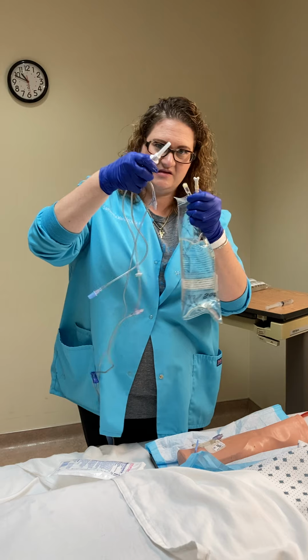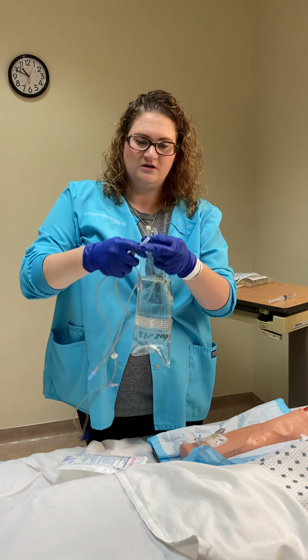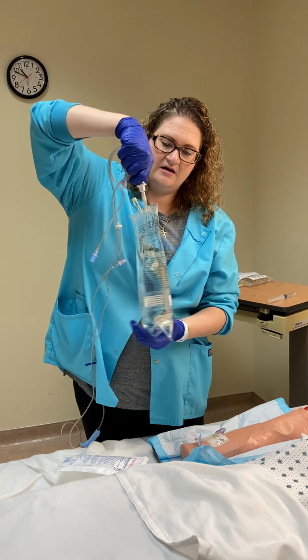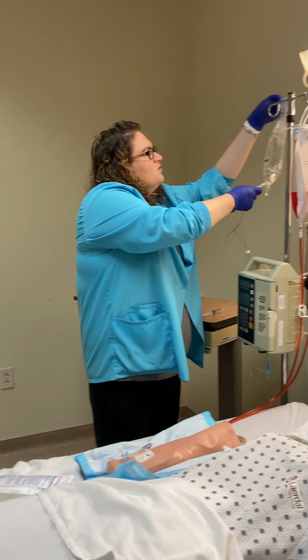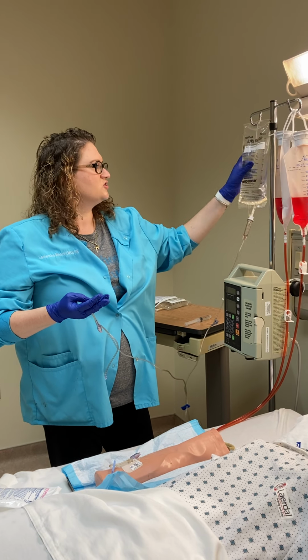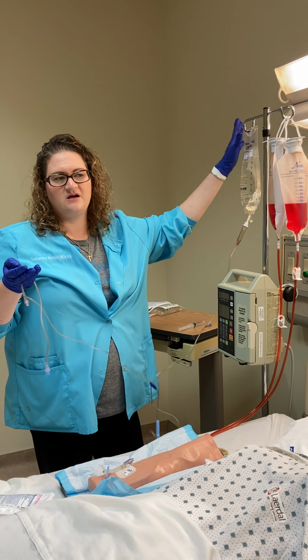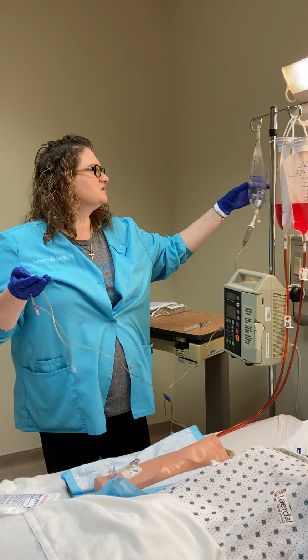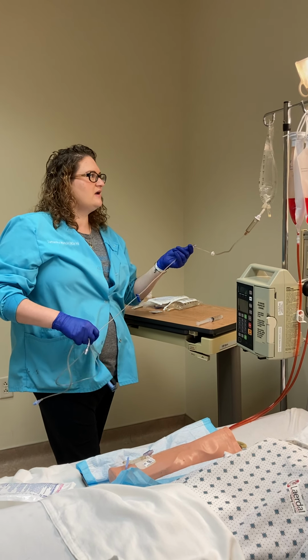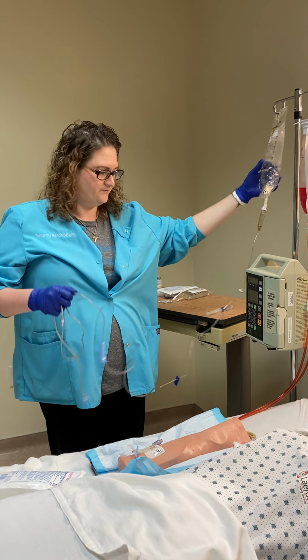But we need to be sterile to sterile, so I'm going to undo my golf tee. I'm going to take my cap off, and I'm going to use some good pressure to spike my bag. Then I'll invert it. We're looking for clarity of the solution. There shouldn't be any floaties. There shouldn't really be any moisture. Now, sometimes the outside of bags, when they're brand new, might have a little bit of residual moisture, but there shouldn't be any leaks or tears or anything like that with the bag. It shouldn't be expired, and we always want to make sure that it matches up with whatever our order is.